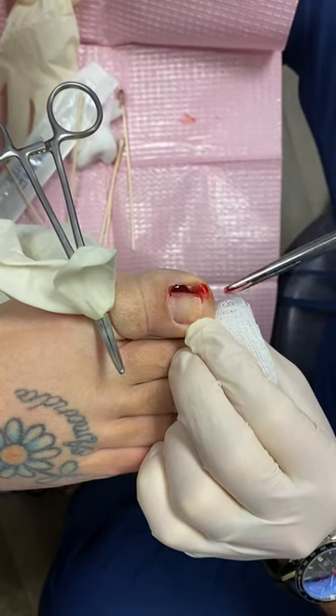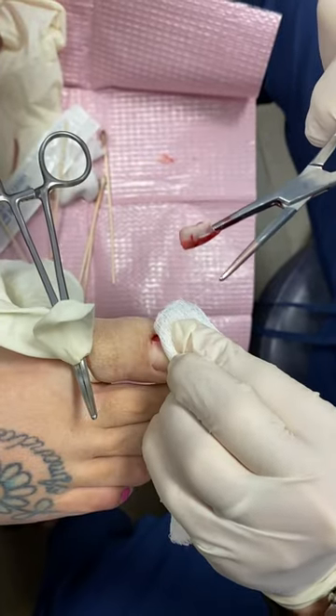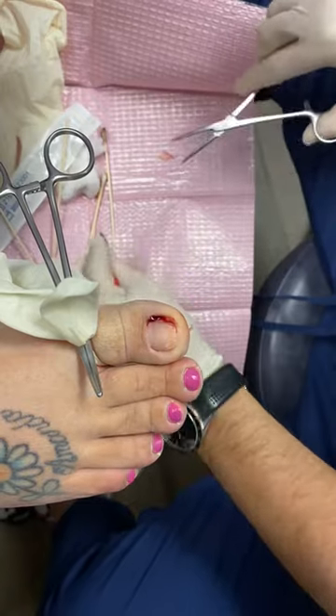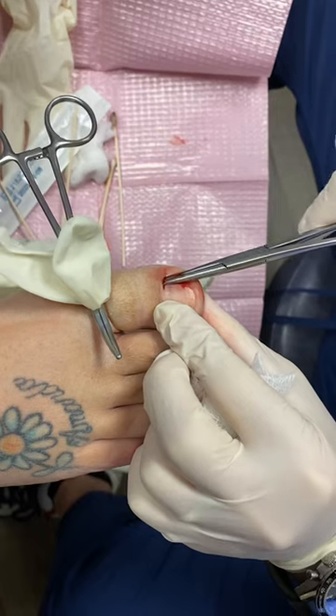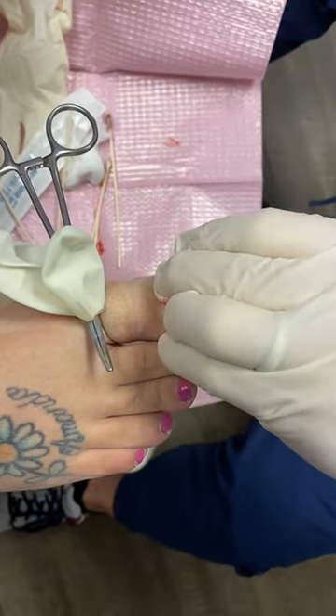People are always surprised how far back that nail goes. There's a little bit more still in there — that nail really goes all the way underneath there. Nails actually grow off of your bone, and your bone is all the way under here.